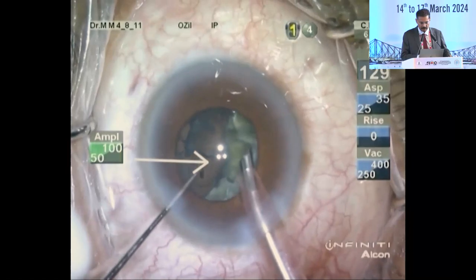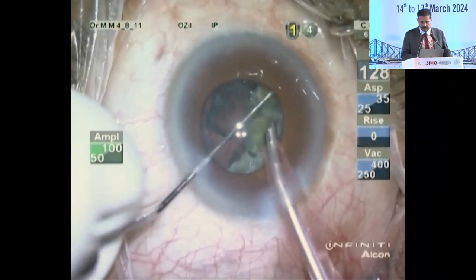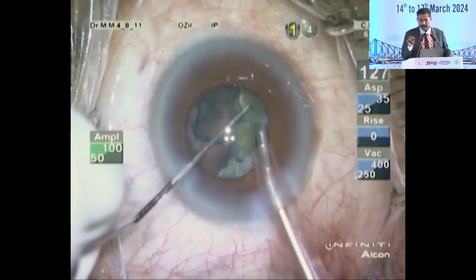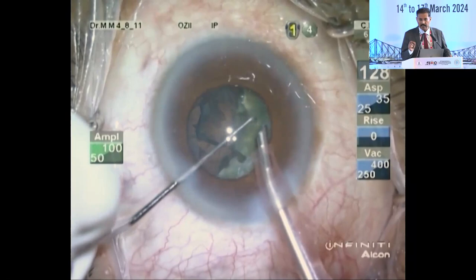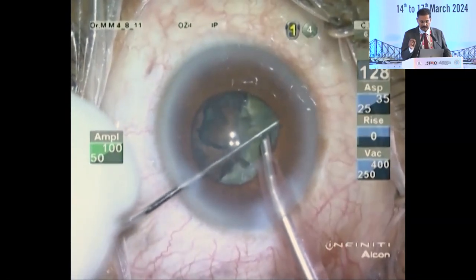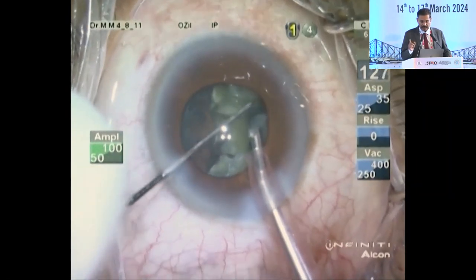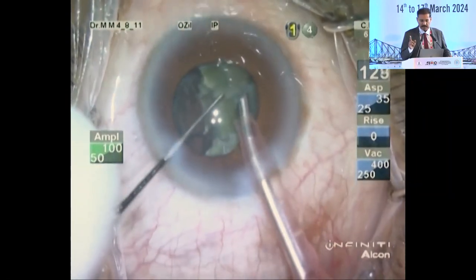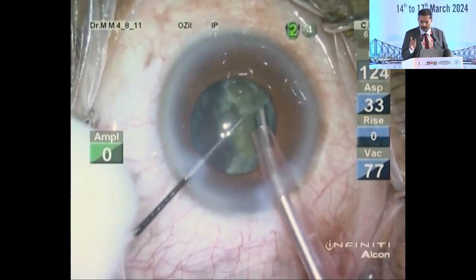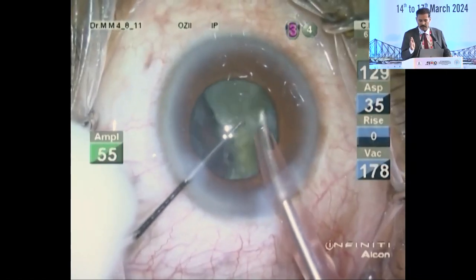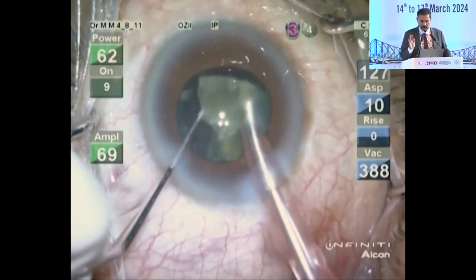When I'm rotating this, see that line there. That's a subtle line which you have to notice on the posterior capsule which doesn't change shape. That means there is something behind the nucleus, which is most probably a posterior capsule rupture.